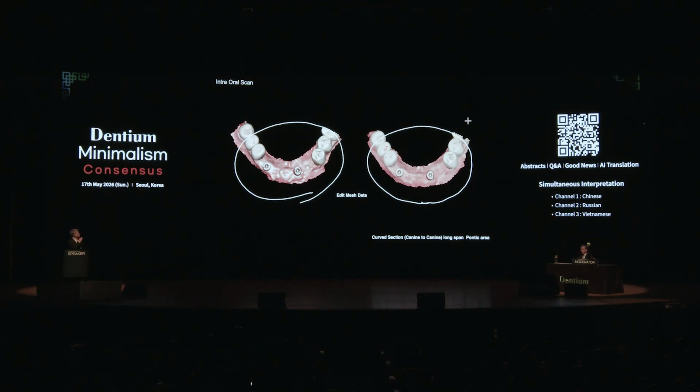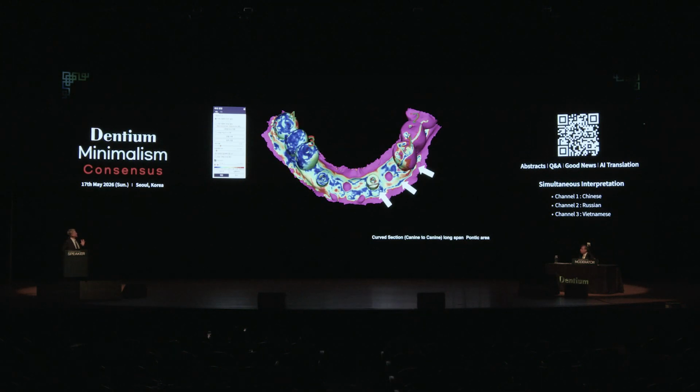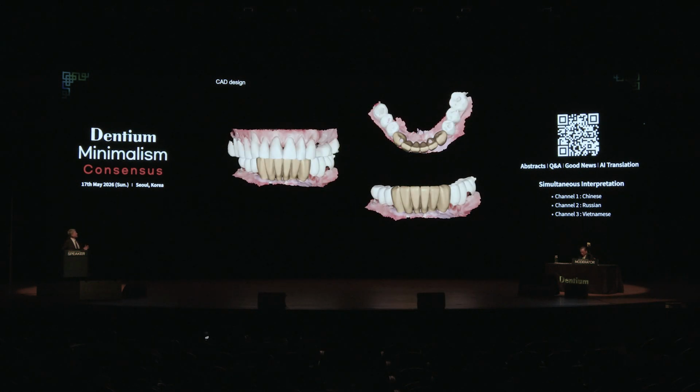Usually, at first we tried this on the crestal areas, but later, for the efficiency of the dental laboratory work, we added the flow resin on the labial or lingual side. With a higher flow resin, dry, that is good enough for the intraoral scanning. Through the stitching, the two images differ a little in precision, but if you add some flow resin, we get very clear images for the final process. So with that, through the stitching in the pontic areas following the scan without any flow resin, we have this virtual design.